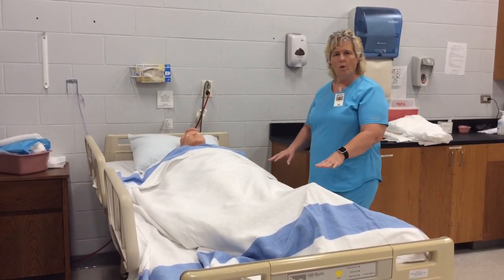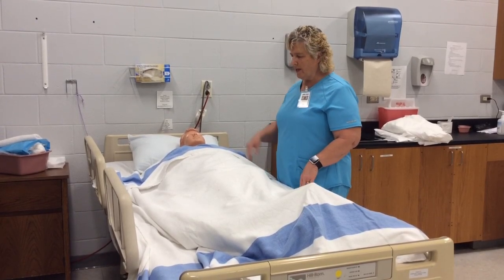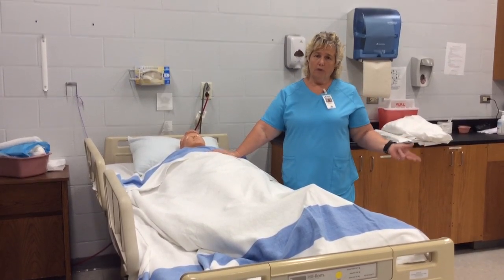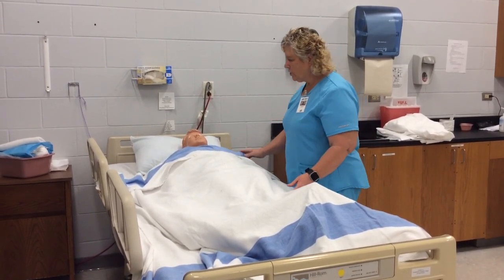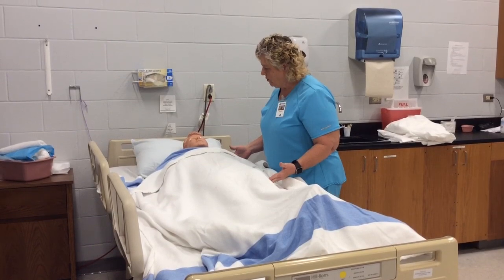So right now I'm to the point on bed making that I have raised the rails, lowered the bed rails next to me, put the bath blanket on, and pulled the sheet down. If you have not seen that skill, it's done numerous times on other skills. So we're to that part. So we're making an occupied bed. So I'm going to need to turn the resident, and I'm going to use the shoulder and the hips.